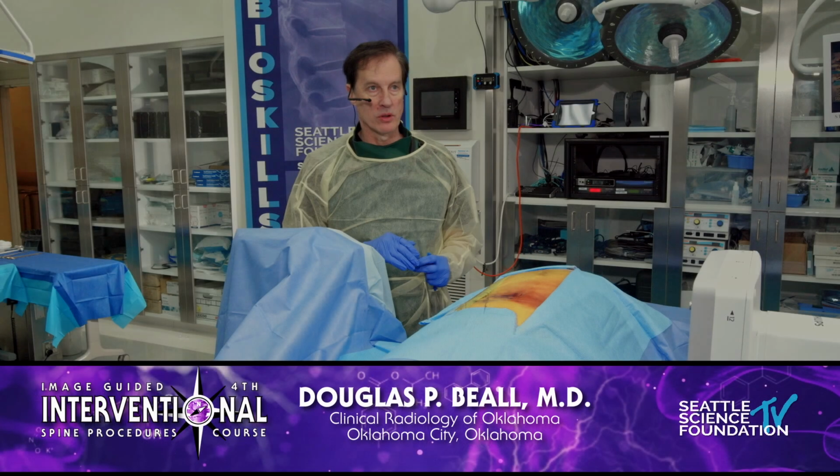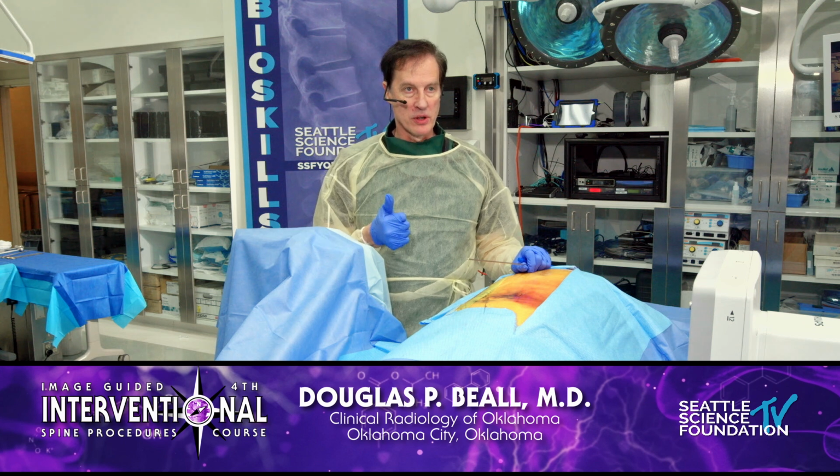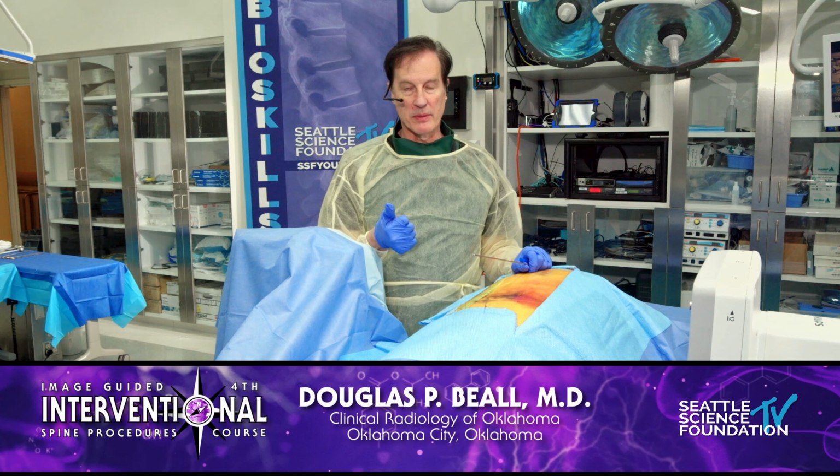SI joint fusion. Okay. We're going to accomplish the lateral and posterolateral approaches. Dr. Dave will be covering the posterior approach in the next section. And so this is for patients that have SI joint pain, SI joint dysfunction, which is not defined by imaging. It's defined by the presence of SI pain.